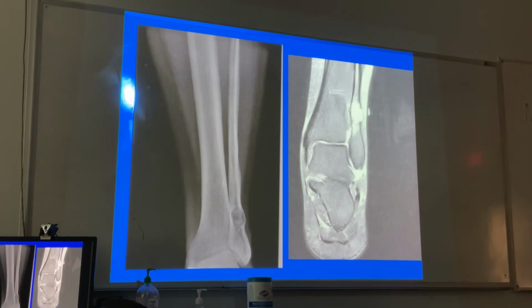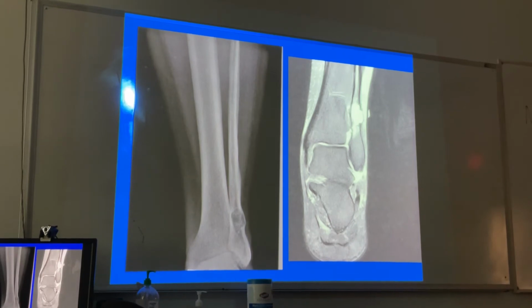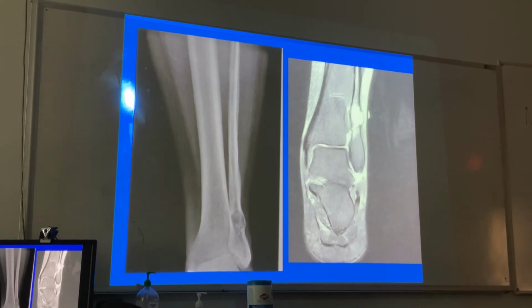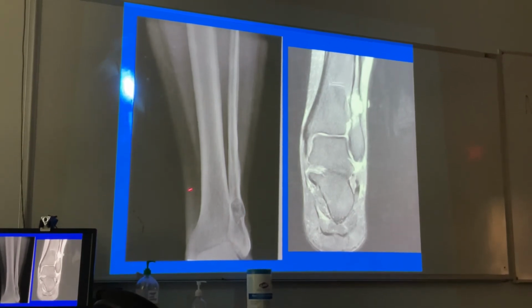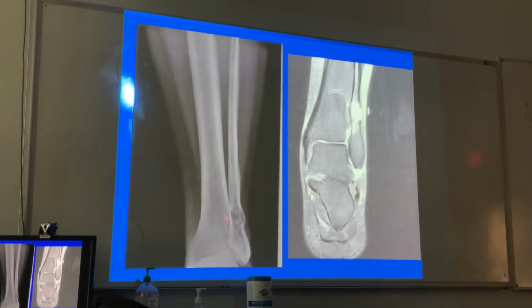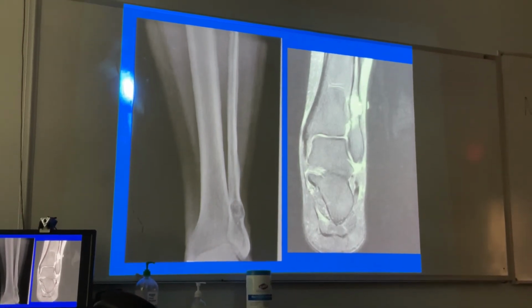So the point is, if you don't know how they took their X-rays, not everybody does anatomic position. In this case, they failed to mark, okay? Chiropractic office failed to put the marker on. All I'm saying is we're using anatomic position, and in anatomic position, we're saying this is the left leg, okay? So there's a problem with the distal portion of the left fibula, okay? They had ankle discomfort, that's what it looks like on an MRI.